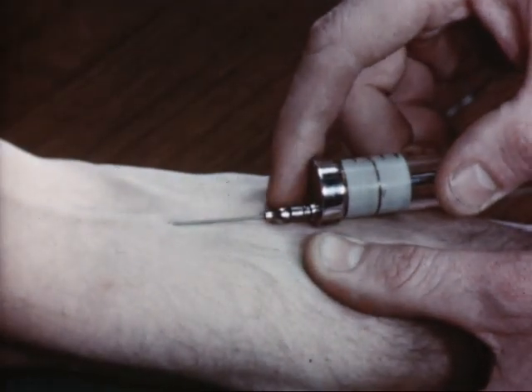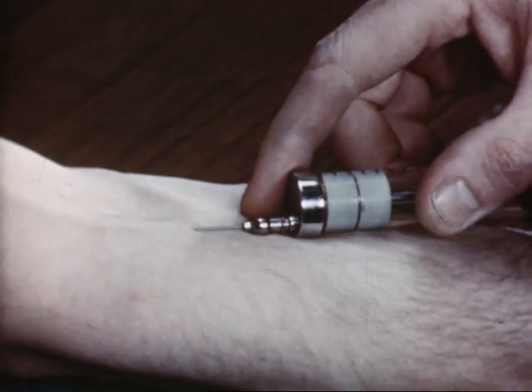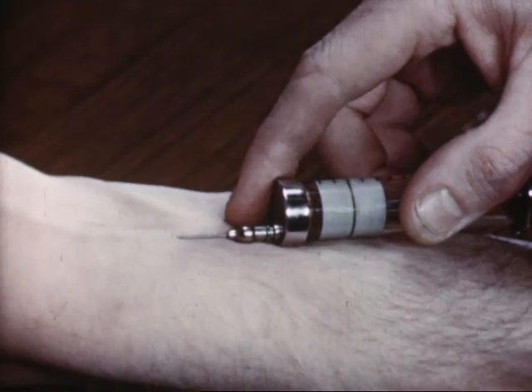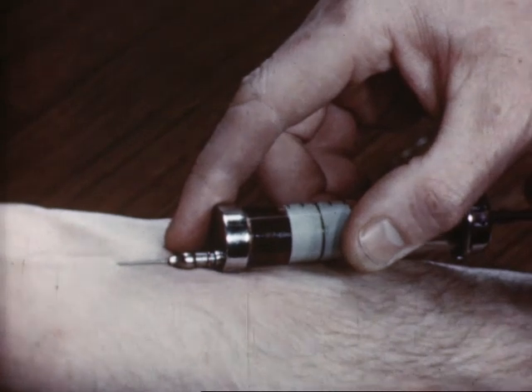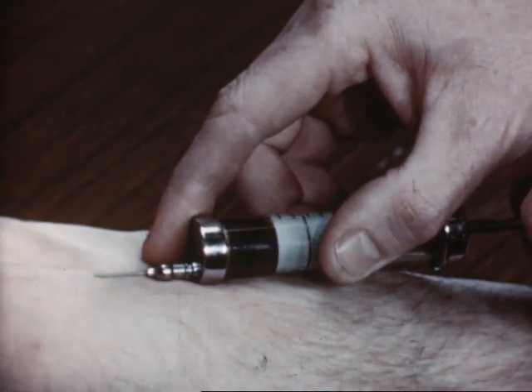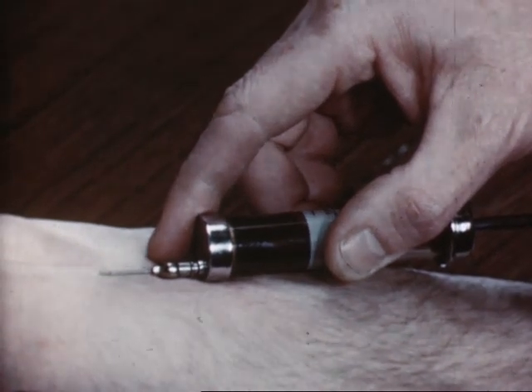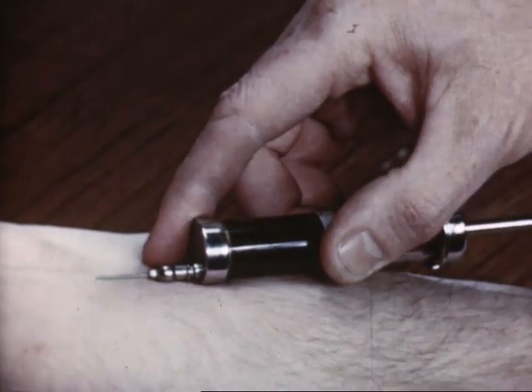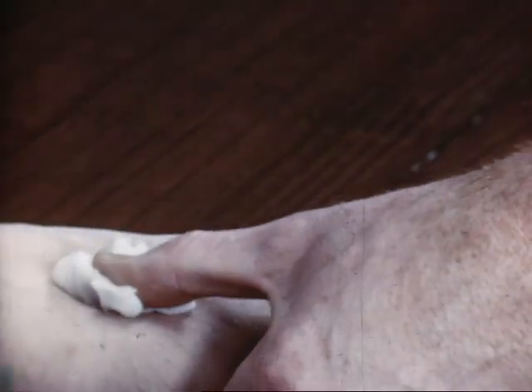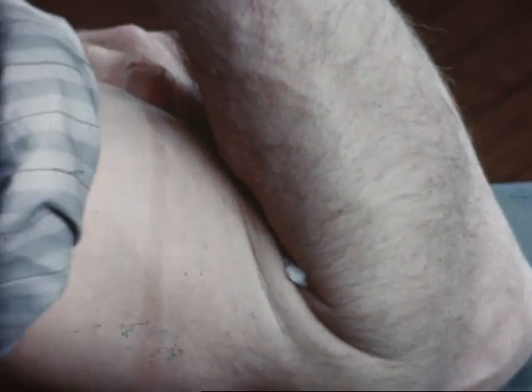Tense the skin with the thumb of the left hand and push the needle steadily into the middle of the vein. Your movement should be fairly quick through the skin. As you proceed you will feel a give when you enter the vein. Don't change hands — pull the piston with your other hand. Keep the syringe perfectly still on the arm to prevent the needle slipping out of the vein. When you have the amount of blood required, release the tourniquet first, then apply a swab, then remove the needle. Before sending the patient away, see that there is no haemorrhage from the site of the puncture.